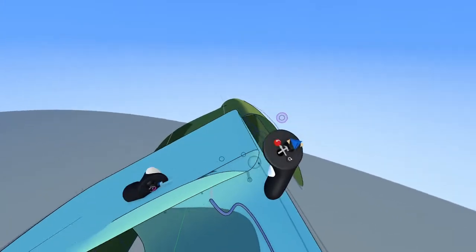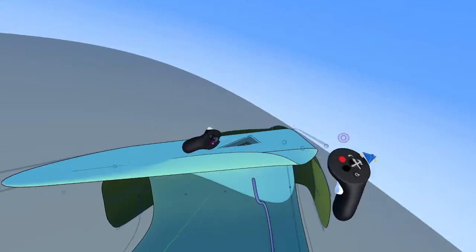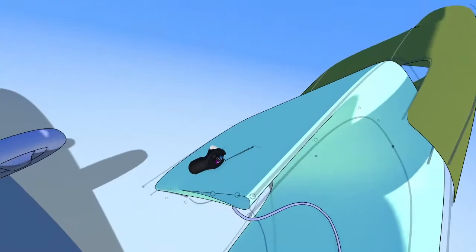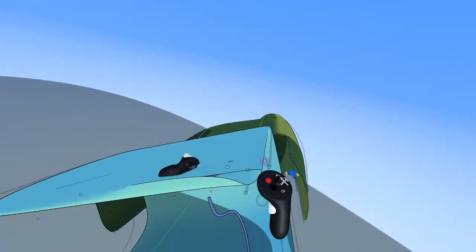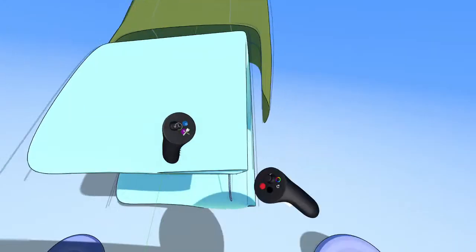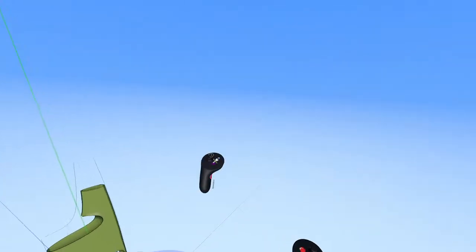Okay, so this is kind of a bit of a no-no here, but basically when you're modeling something with sub D, you want to make sure you have quads going the entire way through a surface. So I have a bit of a problem area here. I'll just demonstrate this over here.